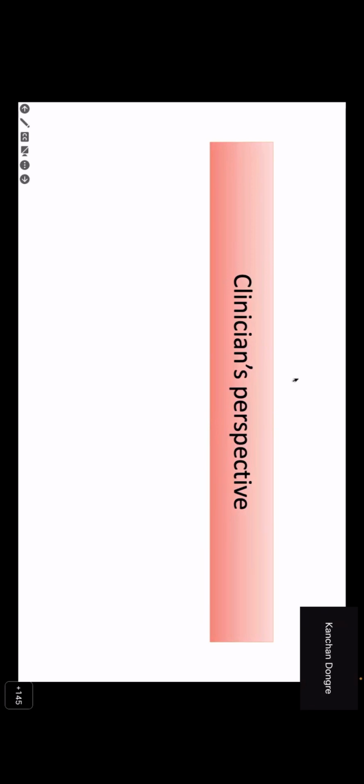The first question is, is there any critical number of significant fragmentation of RBCs per oil field? This was in reference to what is not being written. Acha. So fragmented RBCs are in a scenario of microangiopathic hemolytic anemia.